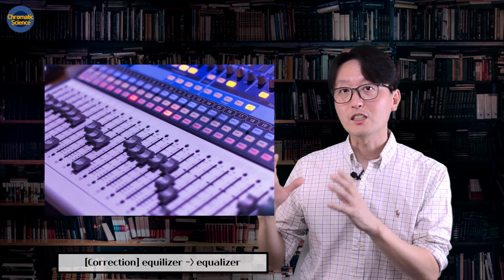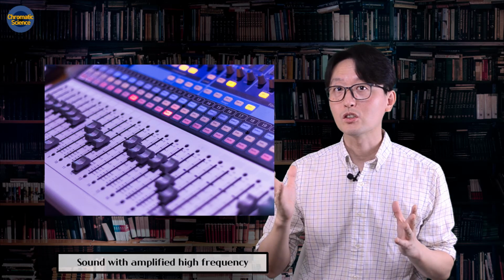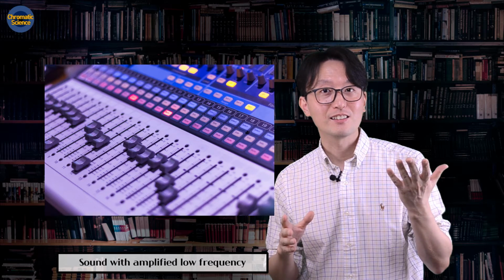One of the examples is equalizers. The sound equalizer converts the sound information to frequency information. Using an equalizer, you can boost the high frequency information like this, or you can boost the low frequency information like this. So as you see here, using the Fourier Transform, you can play with frequencies in sound. In addition to sound, you can apply the Fourier Transform to general functions or even images.